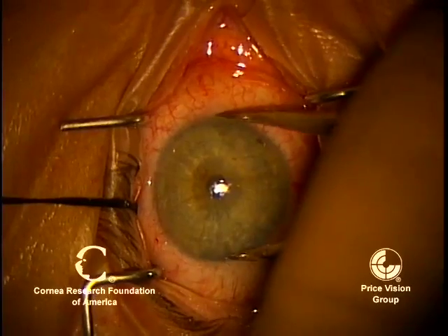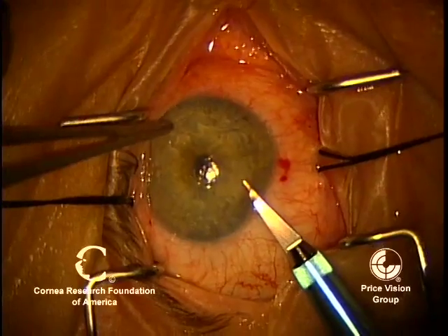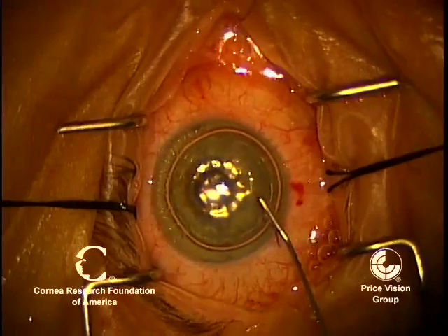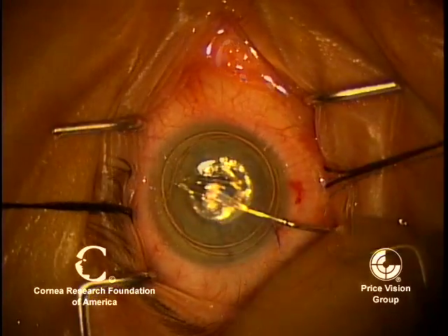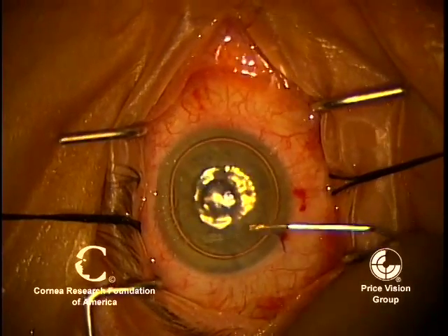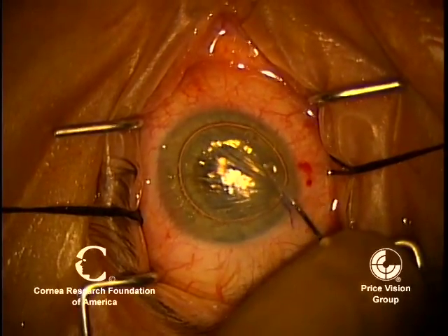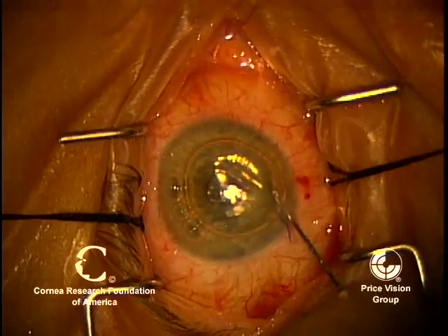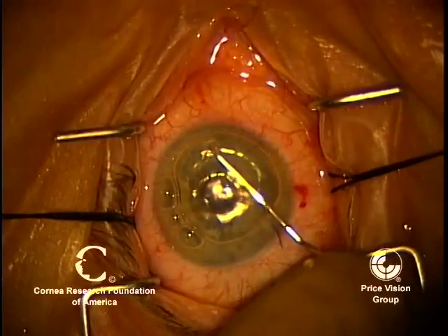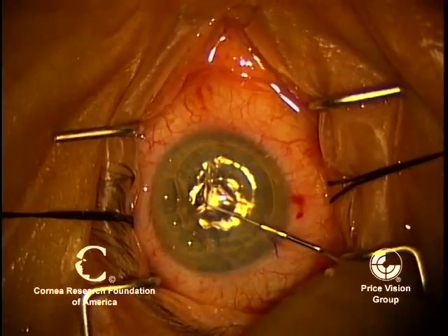On the recipient cornea, I like to always measure the horizontal corneal diameter — it gives us some idea of how much room we have for the donor. We're going to make a stab incision here and then fill the anterior chamber with air. Air gives us very good contrast when we're scoring and stripping Descemet's. Right now we're going to score all the way around, and then grab the edge where we scored with the hook. Without pushing on the stroma, we're going to pull off the Descemet's membrane.